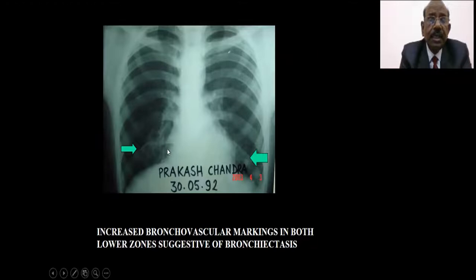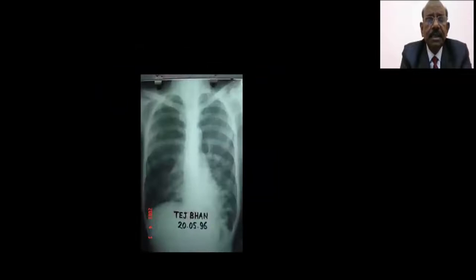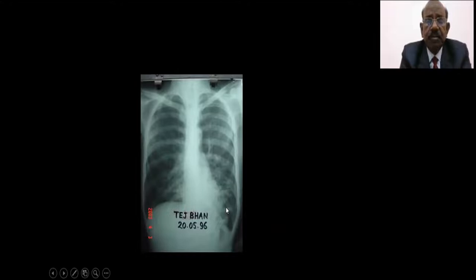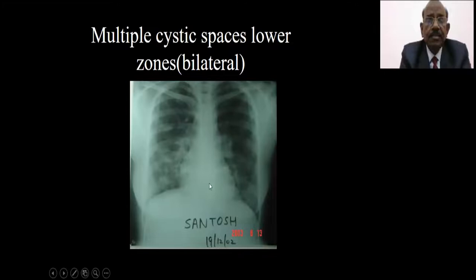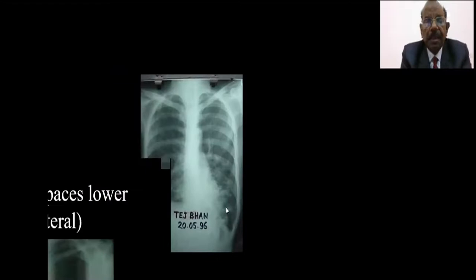In another X-ray you can see that markings are prominent in a localized area on both bases — this was a case of bilateral bronchiectasis. The disease is localized here. You can even see some cystic spaces with fluid levels. These are all proven cases of bronchiectasis. The beauty of radiology is that the disease is usually localized, as the definition says.